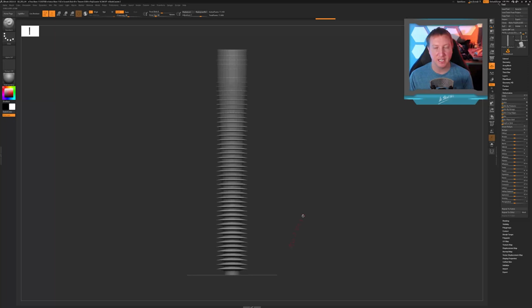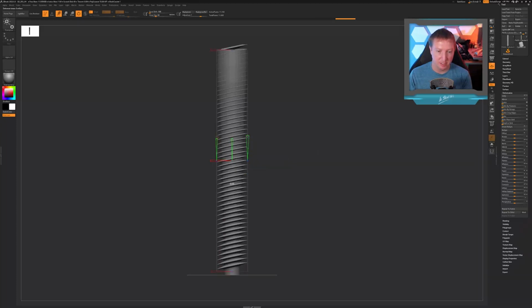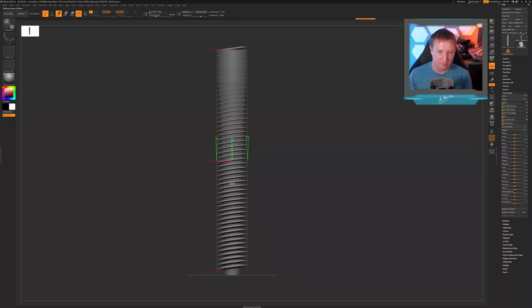And now I need to add some slant to these threads, because I want them to look like threads, because we didn't make real threads. These are full circumference. They're not spiraling up the way a real screw would, unfortunately. But we're only ever going to be looking at this in one plane, so as long as someone can't twist this, they won't realize that the threads aren't continuous. So that's okay. Now I need to come over here to my move menu, come up to skew, and slant these up here a bit. Let's see what the angle of the slant is. They're not too slanted. Okay, so just a little bit. All right, that looks pretty good.